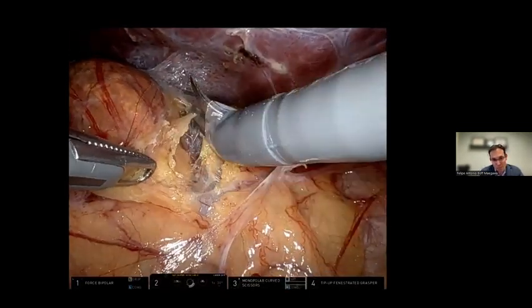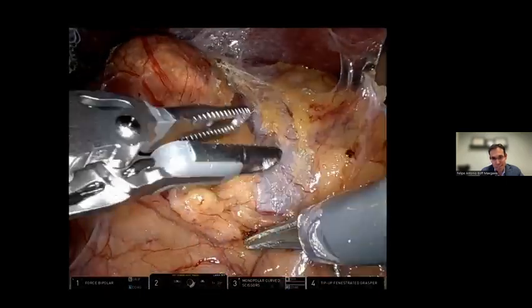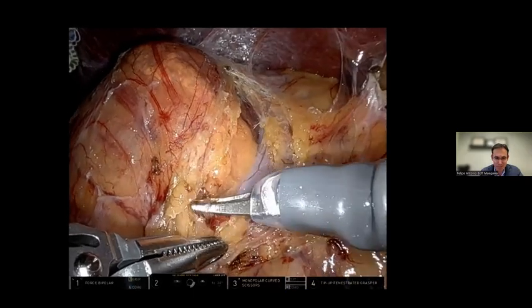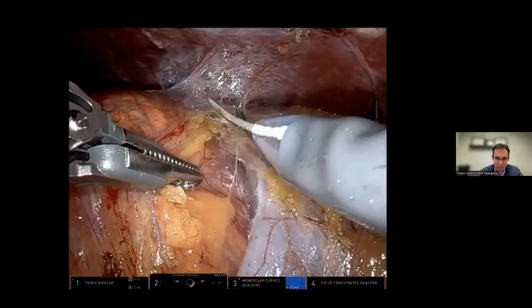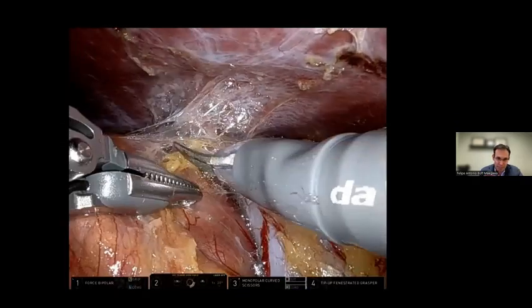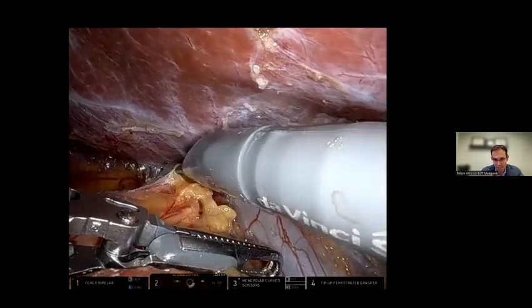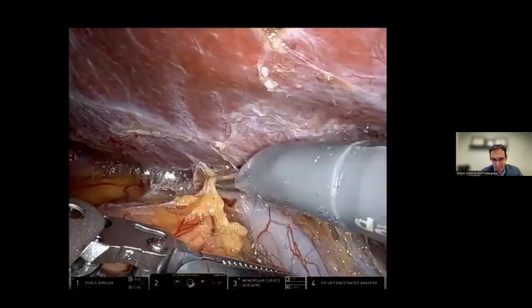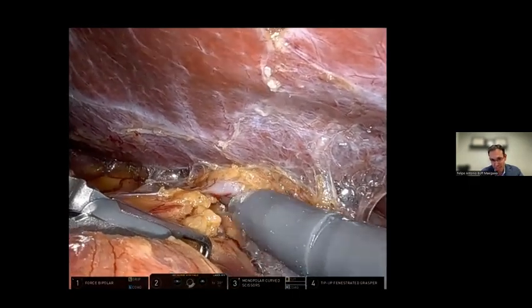So we open the groove between the IVC and the adrenal mass and nodule there. In this case, it was a 5-centimeter nodule, pheochromocytoma sitting against the renal vein. So we expose the confluence of the renal vein and IVC. And we keep on this meticulous dissection layer by layer so we don't have bleeding obliterating the areolar plane there. It's easy to find the adrenal vein if you have that plane intact.